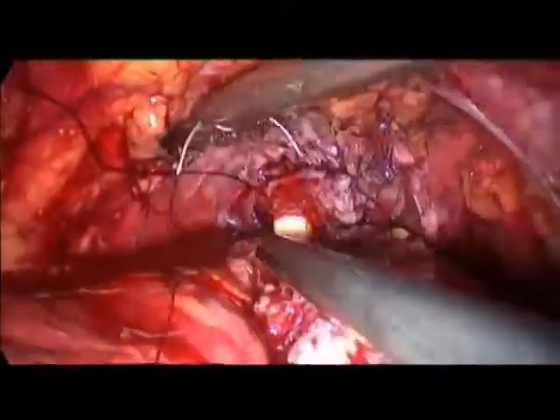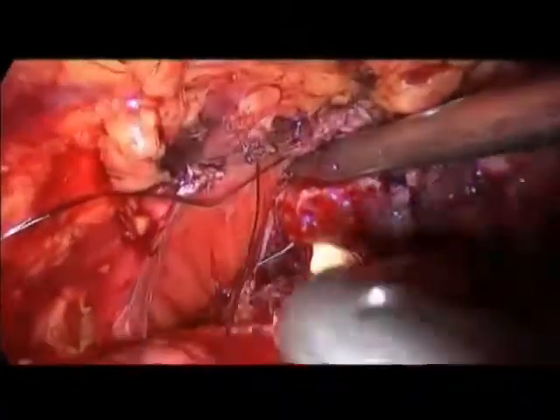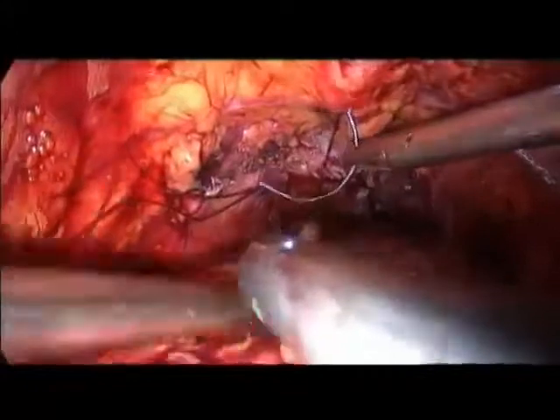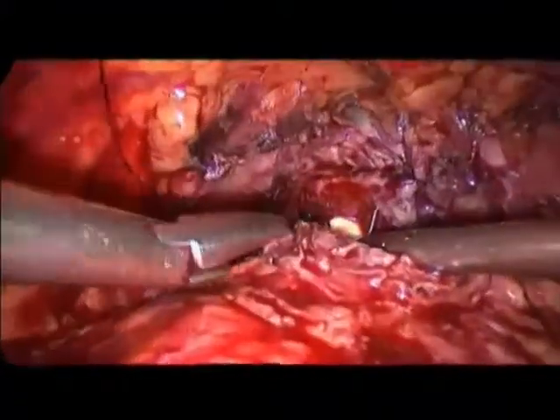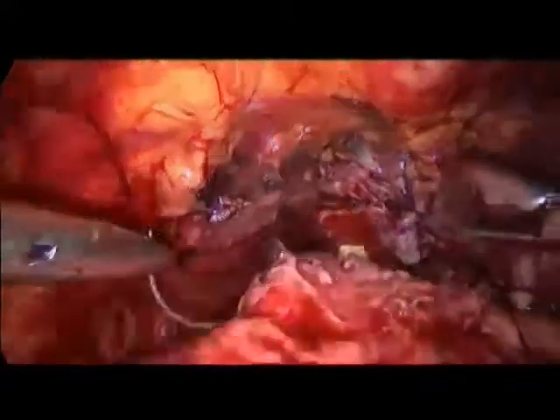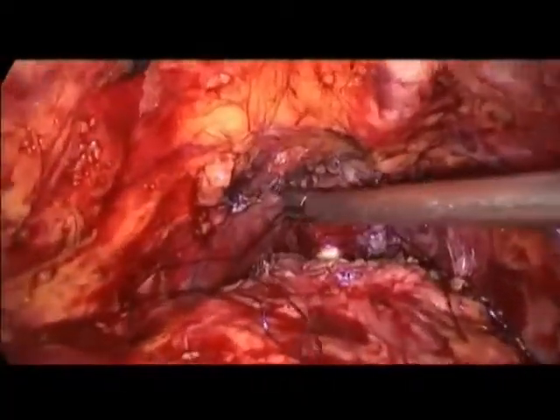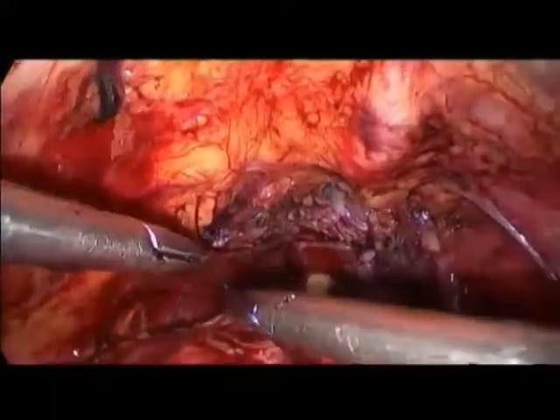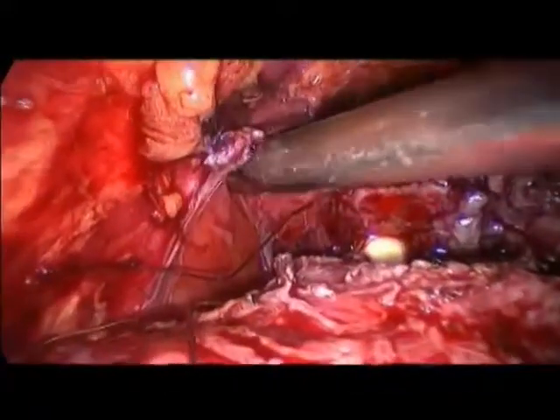How long is the suture that you are using now? I took a 20 centimeter to be sure to have a sufficient length. We are starting again here at 10 o'clock, as you can see. And immediately loading the other side. I don't see my small leg. Yeah, it's there.